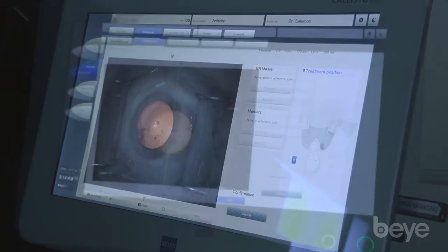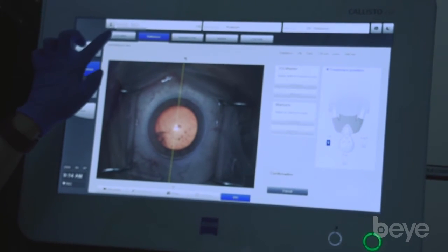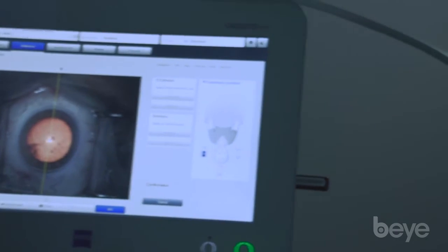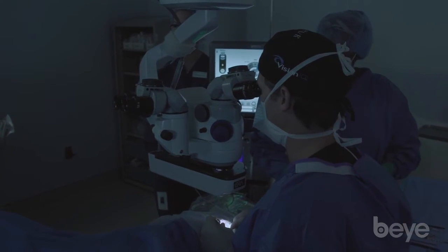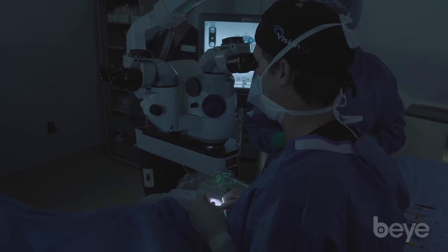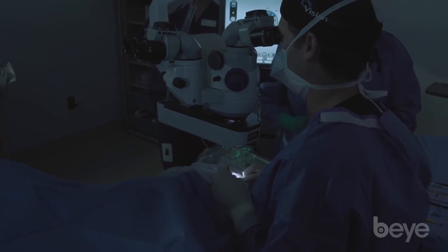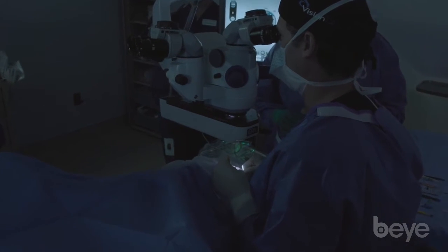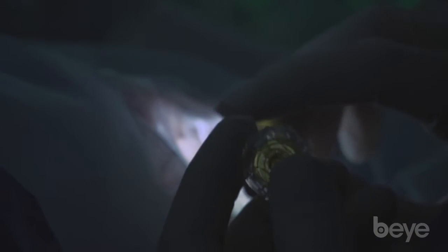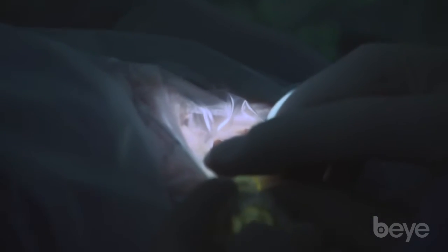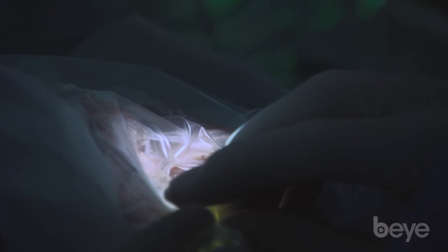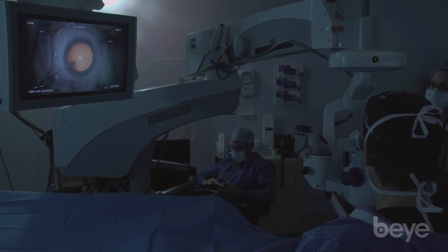We can go ahead and overlay — hit live surgery. What you're seeing on that screen is exactly what I'm seeing, and we have the opportunity to completely overlay. It's not just a matter of lining up a toric IOL. We can also consider factors like the coaxial light reflex — as my good friend Daniel Chang put it best. Angle kappa is going to be important. Lining up the capsulorrhexis is also going to be important, and the overlay allows us to make our capsulorrhexis to that reference.